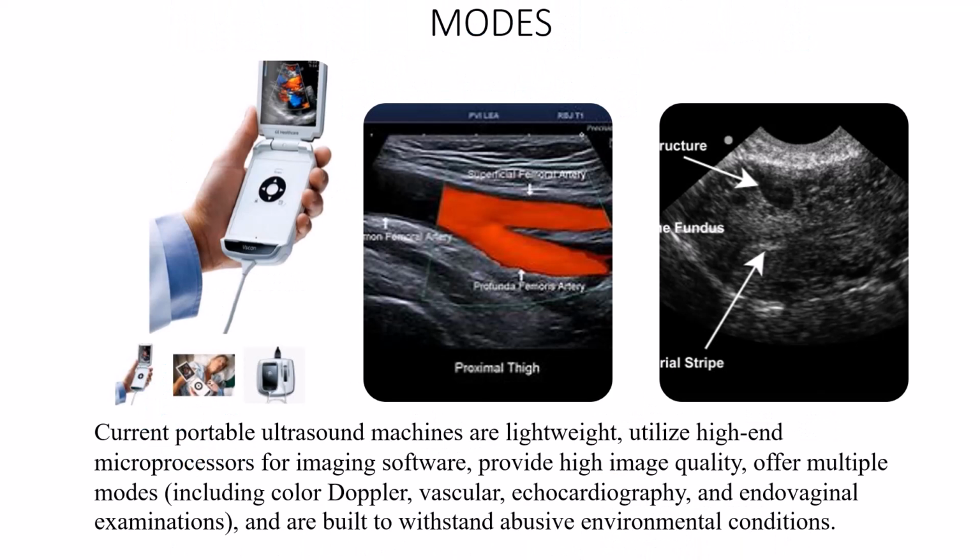Ultrasound transducers produce pulses of ultrasound waves. These waves travel within the body and interact with the various tissues. The reflected waves return to the transducer and are processed by the ultrasound machine. An image which represents these reflections, or differences in intensity of the waves collected, is formed on the monitor.